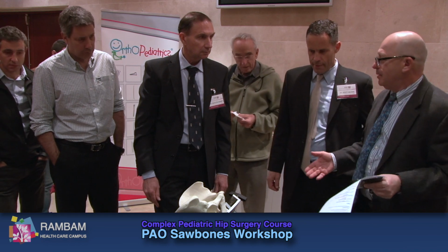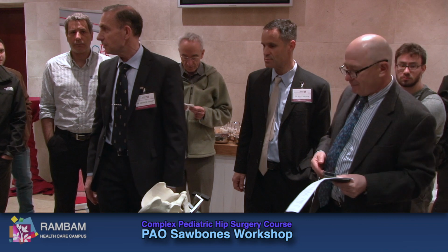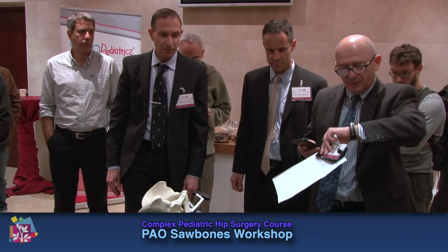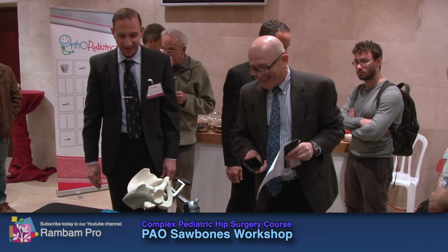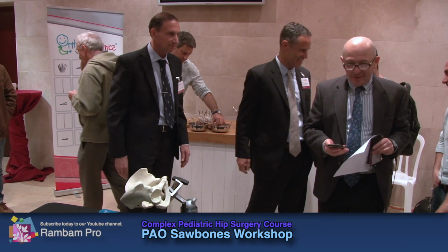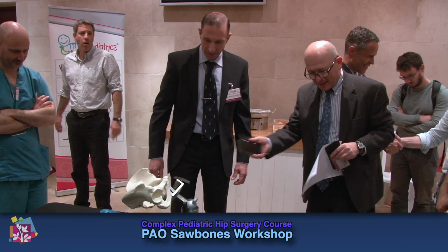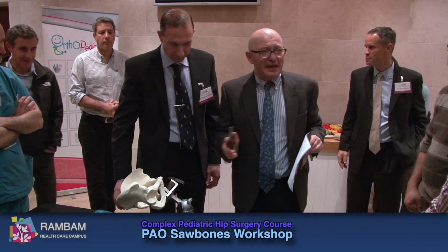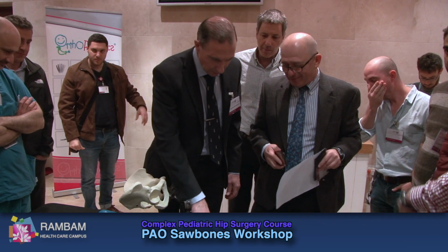Exactly. So, time for bone cuts. We will come around and help you, answer any questions, and critique your results. You have 15 minutes to cut. Okay. So go to the table. We are very limited in time, so look and do by yourself.